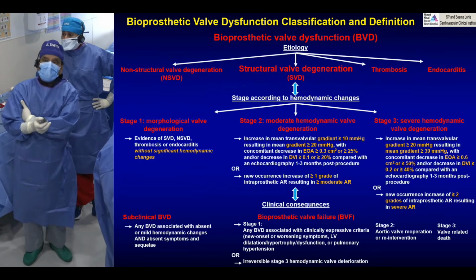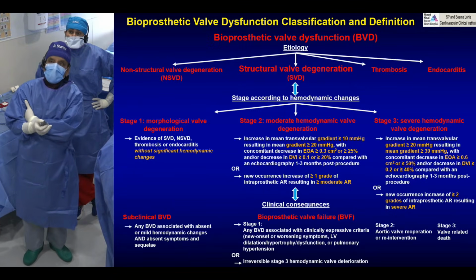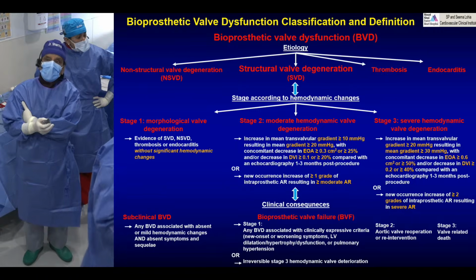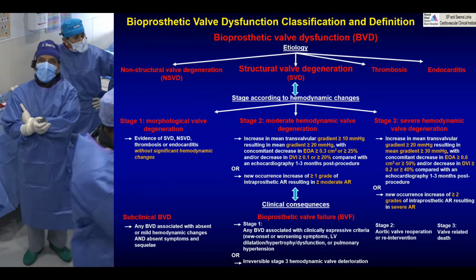Okay. So these are the structural, and basically what we do is, once you have structural valve degeneration, there are hemodynamic stages. One is you just have a little bit of gradient and no symptoms.